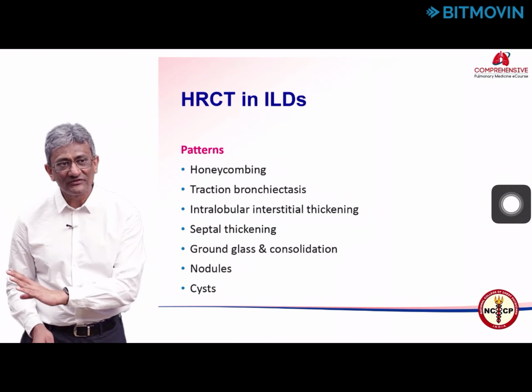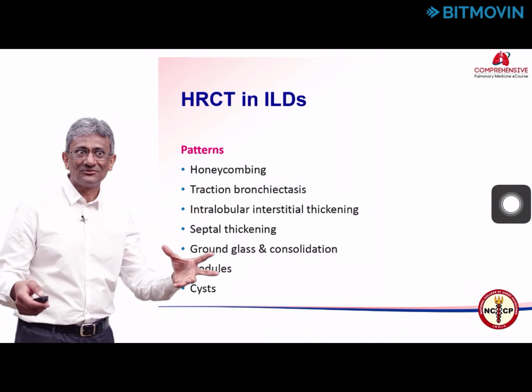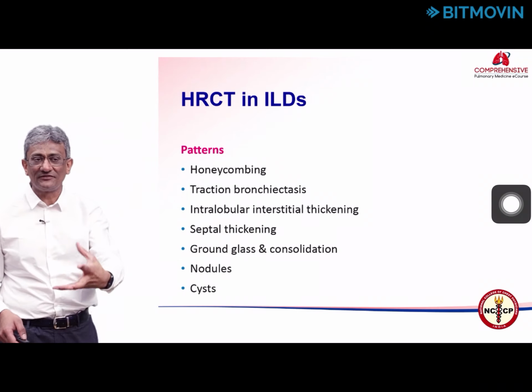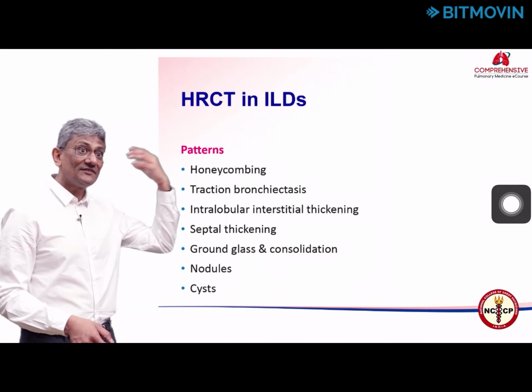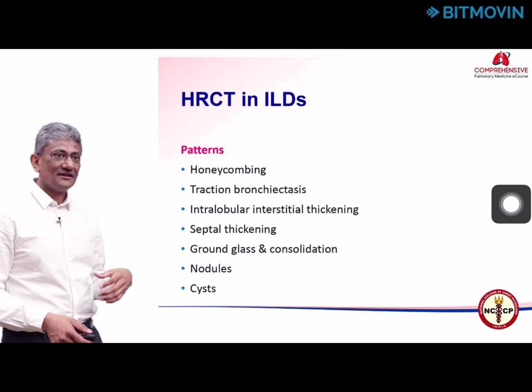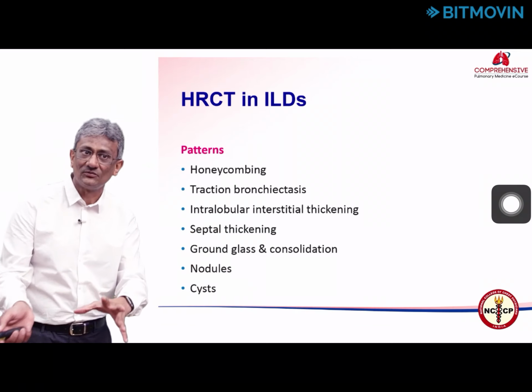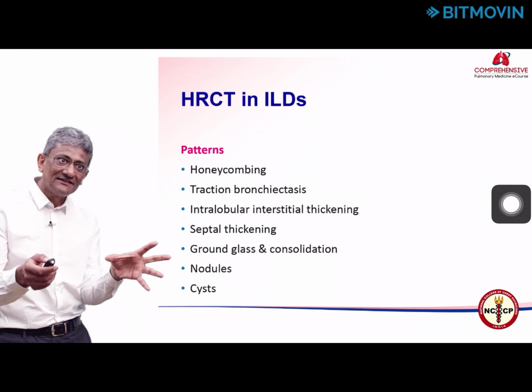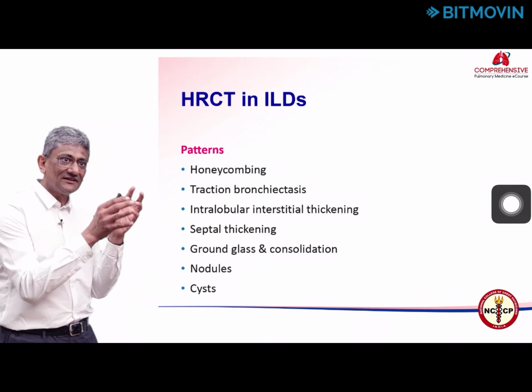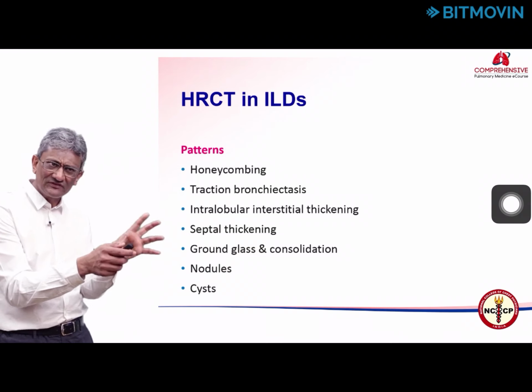The non-fibrosing ILDs present with ground glass, or as we use the term ground glass plus, where it's ground glass with consolidation, ground glass with septal thickening, ground glass with fibrosis. Or then we have septal thickening itself without other findings. Then we have nodules, or predominantly nodular diseases that are either ill-defined or well-defined. And then with all of this understanding coupled with the clinical presentation, we can often make one diagnosis or give a short differential in most instances.